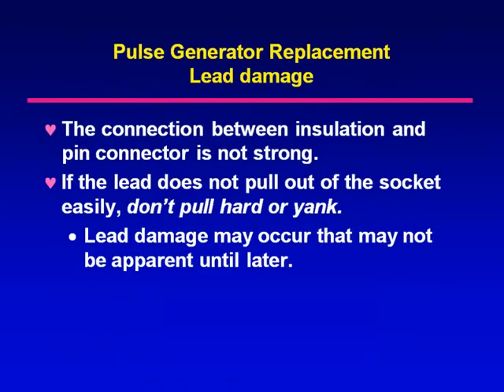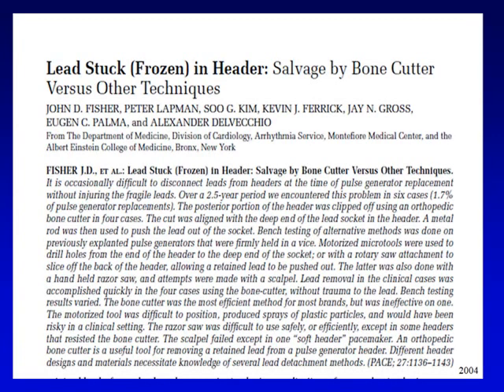Be careful of these. I want you to change the posture to look at the lead. If the lead doesn't come out of the socket easily, don't pull hard, because you can damage the lead.